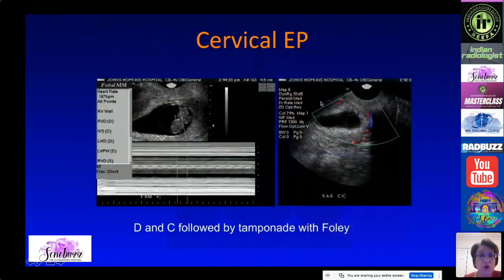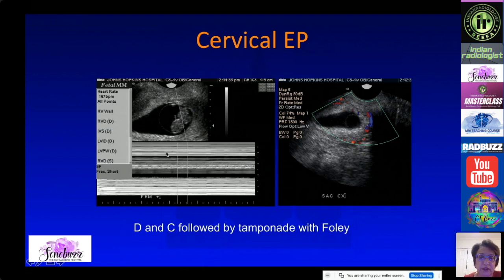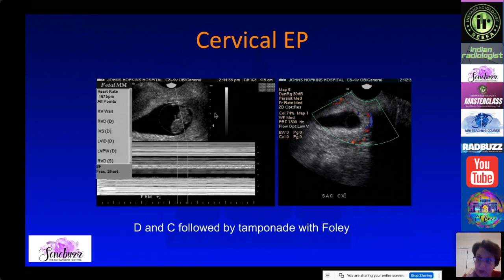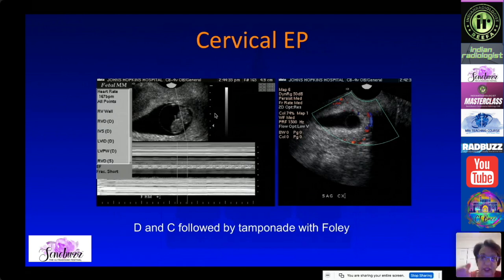Here is an easy example because there was a live fetus in this cervical ectopic pregnancy. It was very difficult to treat — they performed a careful D&C given the major risk of bleeding, then placed a Foley balloon in the cervix to tamponade it, and this was successful.